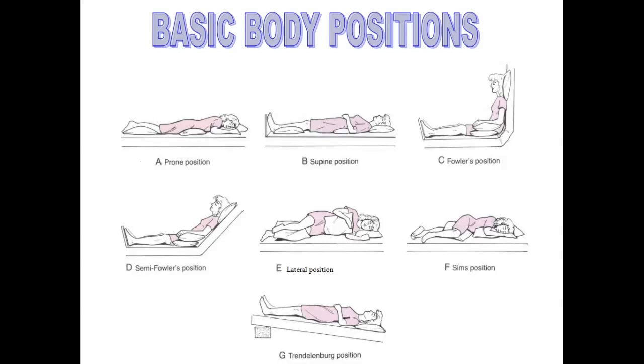Please note the pillows which are arranged to prevent pressure on the body. At the different pressure points, pillows are placed to prevent direct pressure of the body over the bed.